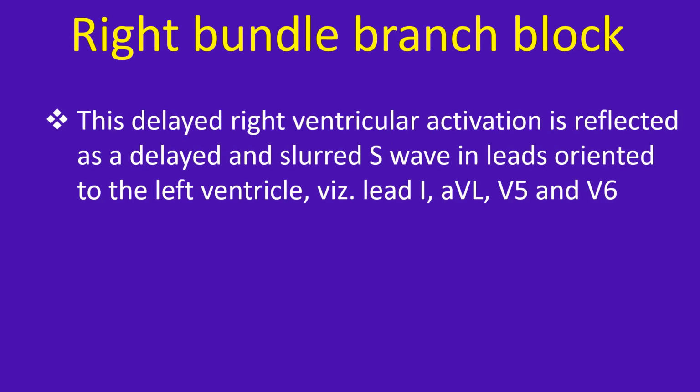This delayed right ventricular activation is reflected as a delayed and slurred S wave in leads oriented to the left ventricle with lead 1, aVL, V5 and V6.